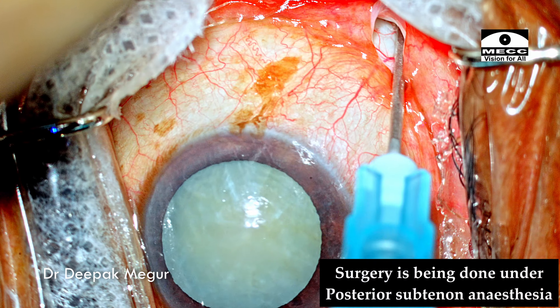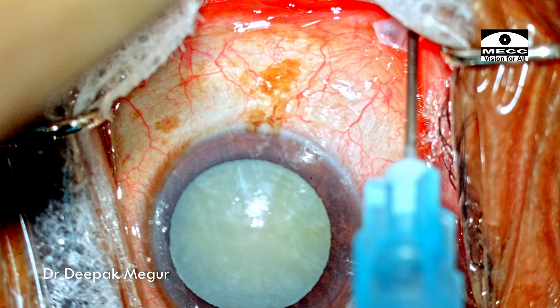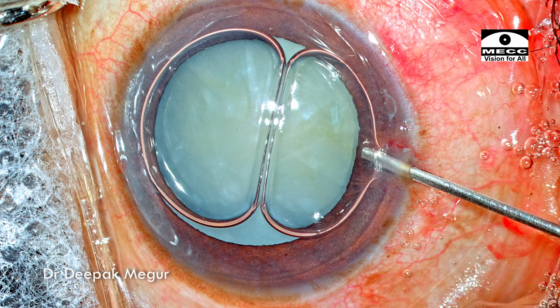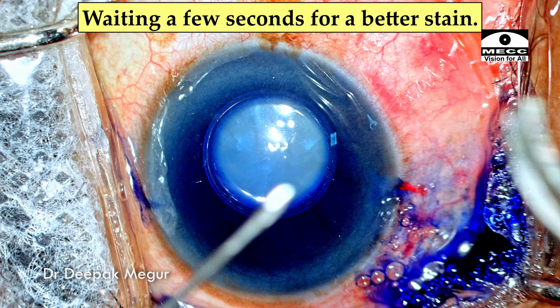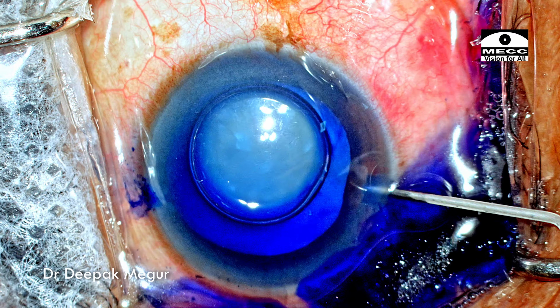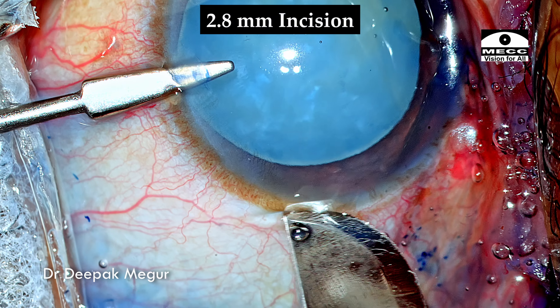The surgery is being done under posterior sub-tenon anesthesia. I'm using a blunt cannula under a small conjunctival peritomy in the inferior medial aspect, and I'm going to inject 1 ml of lignocaine. Important things to note in these white cataracts: we need to get very good staining. I ensure that adequate amount of trypan blue is placed in the chamber under the air bubble, and I'll wait a few seconds allowing the capsule to take up the stain very well — usually around 10 to 15 seconds. That's the time I use to bend my cystitome. The dispersive OVD is introduced into the eye to pressurize the chamber, and then I create my main incision which is 2.8 mm.